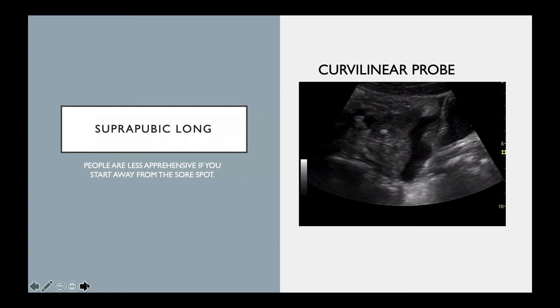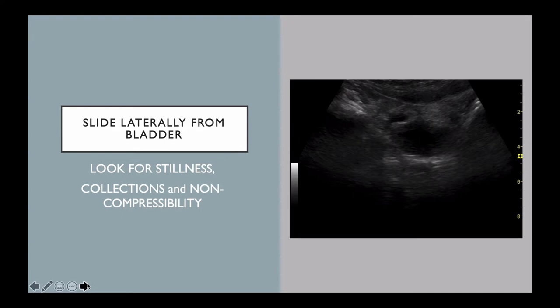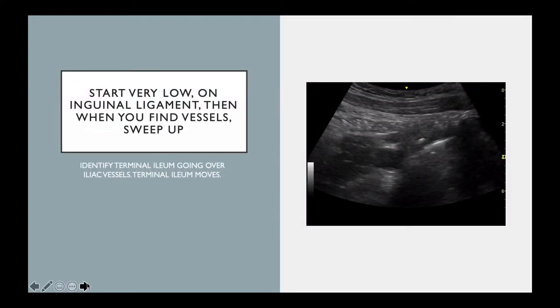So I start with a longitudinal view, then I turn 90 degrees and have a look at the bladder in transverse. And from this time, I slide sideways towards the patient's right paracolic gutter and towards my hip and as low as I can on the abdomen so that we're just about the level of the inguinal ligaments or the pubic symphysis. And as we slide laterally, we're looking carefully to try and find the iliac vessels, the artery and the vein.